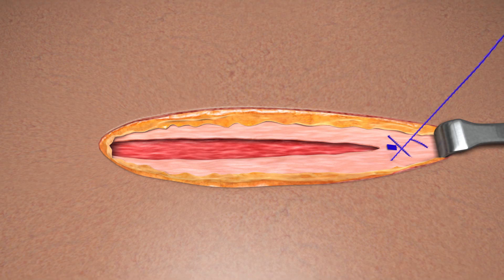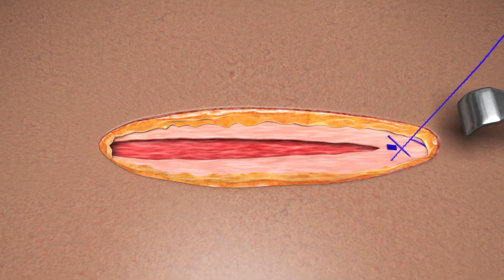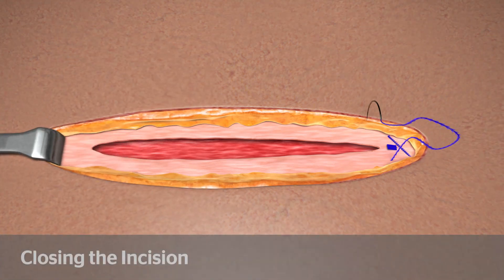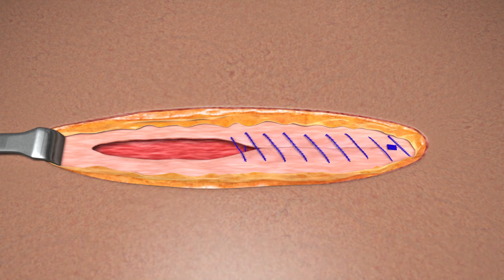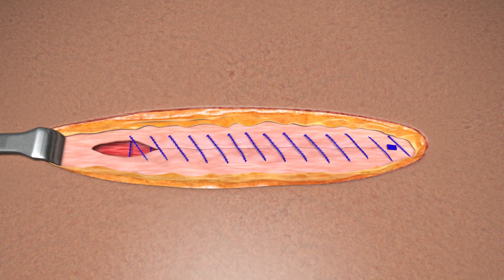Proceed with a continuous suturing pattern to close the incision, taking opposing bites on either side of the wound in standard fashion to achieve the desired approximation and tension. Gently pull on the device with each tissue passage. Continue approximating along the length of the incision, taking care not to over-tighten the device.